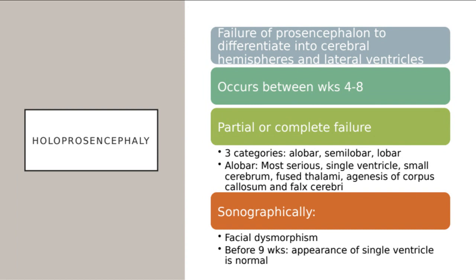So here we have our little bean, right? You've got an 8-weeker, 7, 8, 9-weeker. You may have seen that baby, and you're like, okay, cool, I got a crown rump length, beautiful. And then you may have seen the back of the baby's head. You may have seen a perfectly cystic area. That's going to be your rhombencephalon.